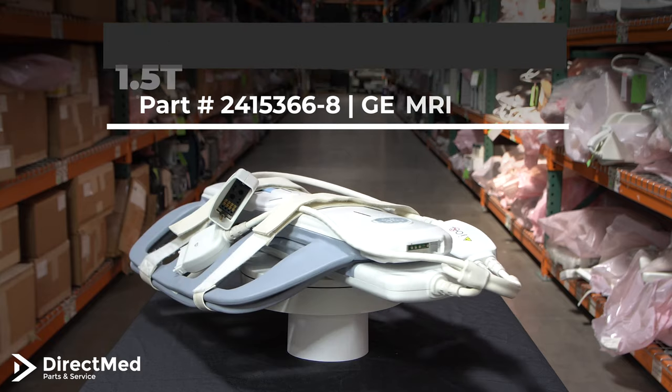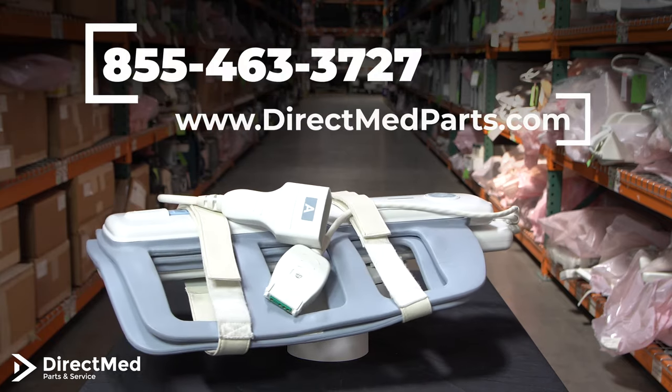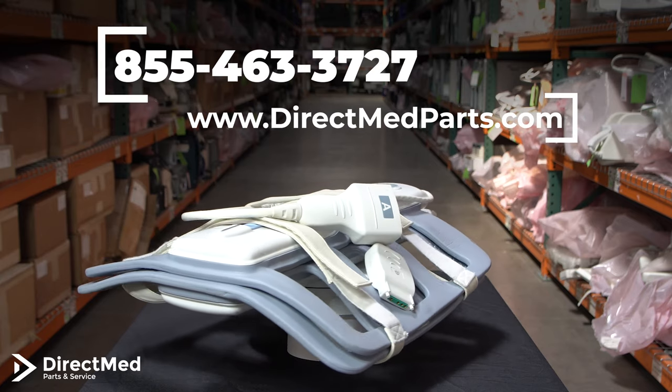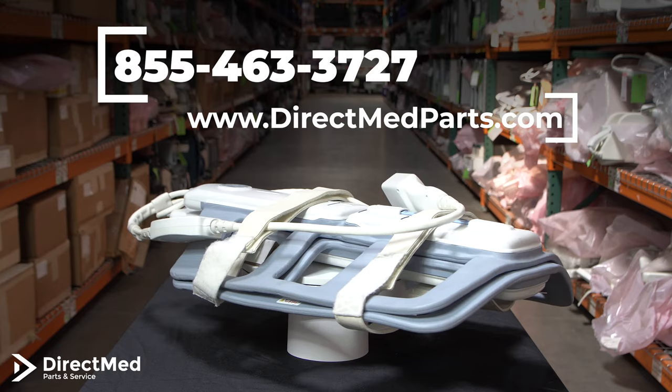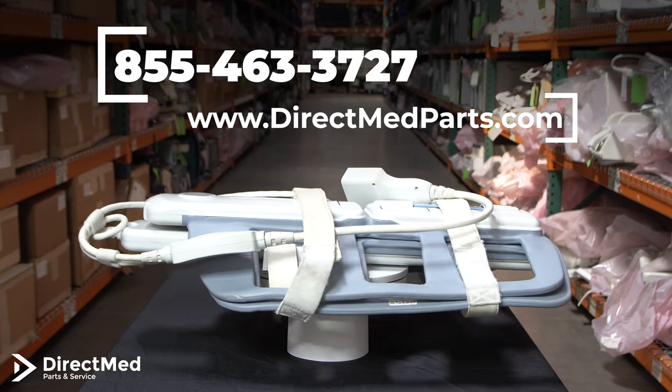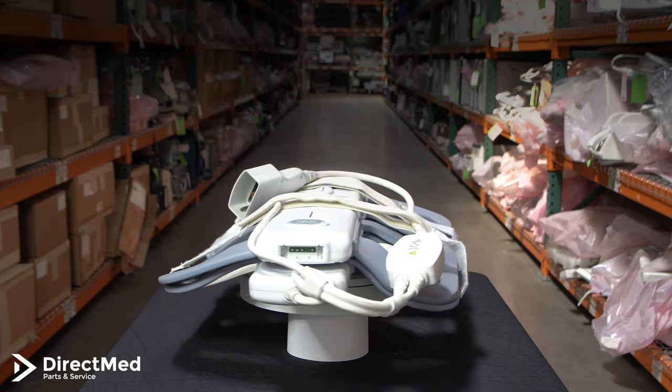It is system tested and it comes with a minimum 90 days warranty. We are also available to provide technical support to you or your field service engineers. If you need this coil, feel free to give us a call at 855-463-3727 or visit our website directmedparts.com for more information. Thank you.